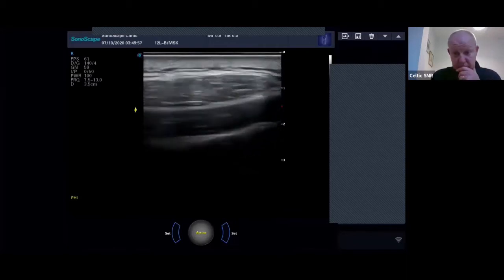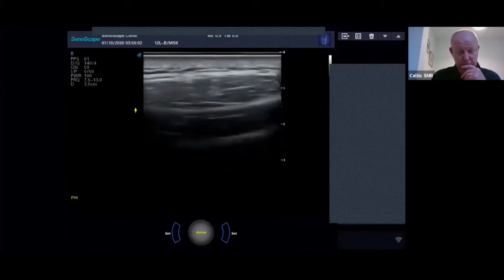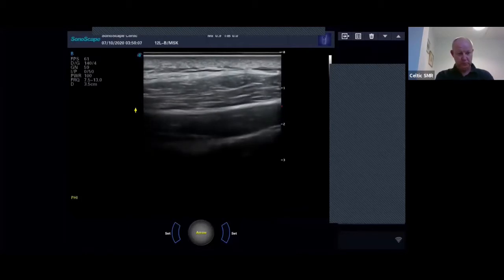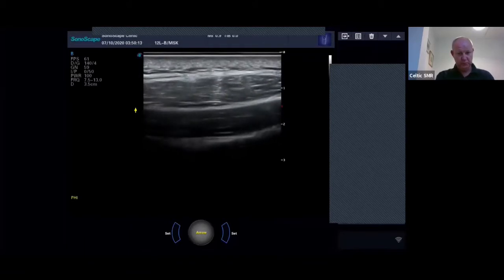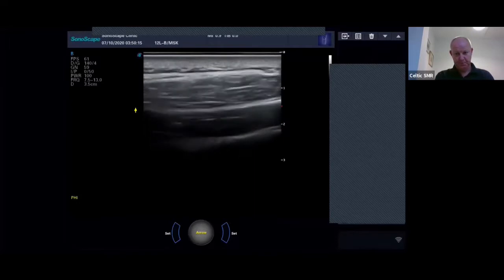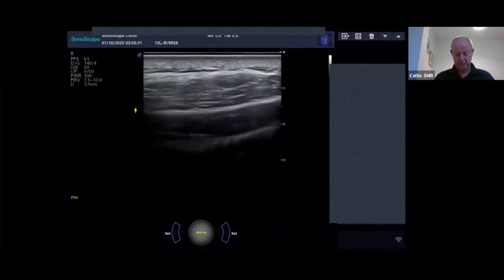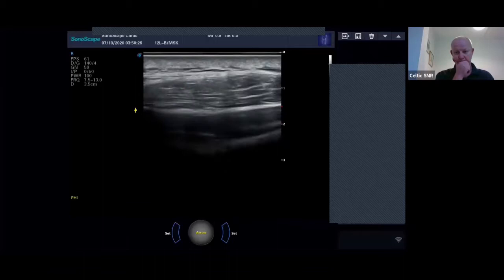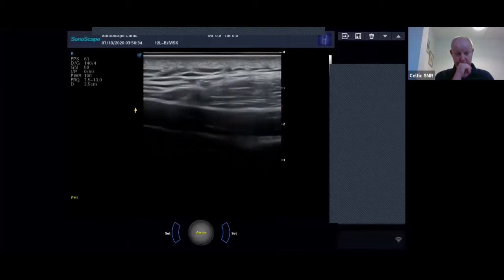How do you differentiate, again for the audience, lipoma from something more sinister? Yeah, okay, well, it's difficult because there's a lot of crossovers and you have to be very careful. But I'll list the characteristics. So one, is it oval shaped? Is it irregular shaped? What's the shape of it? If it's irregular, then obviously that's not a good sign. If it's more oval, that's a better sign. In its contents, is it all cystic? Is it solid? Is it mixed echogenicity? Just look at the contents.